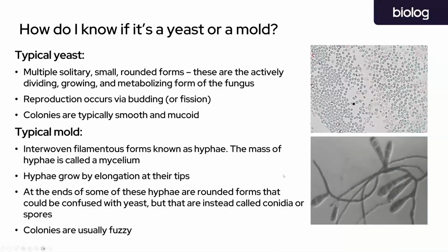Just sticking with fungi for a minute, because I know these are so interesting and they're actually pretty hard to identify with other methods. What are the challenges with identifying some of these fuzzy molds with other methods like sequencing or MALDI? So the first thing is going to be the ability to use high throughput and easy DNA extraction tools like column kits.